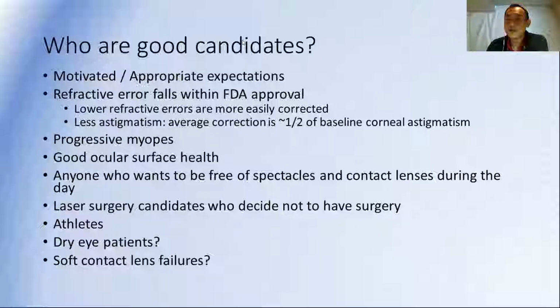Does the patient's acuity vision change during the day? It can, especially when you're trying to correct high levels of myopia with this treatment. The corneas do regress a little bit during the day, but that becomes less and less the longer they do the procedure. Like I mentioned earlier, the early changes are really cell compression, and that rebounds fairly quickly during the day, but cell migration does not. So if you have a movement of cells from the center to the periphery, that takes much longer for vision to change. And I actually have some patients who can go 2 days without having to wear their lenses, and they do just fine.